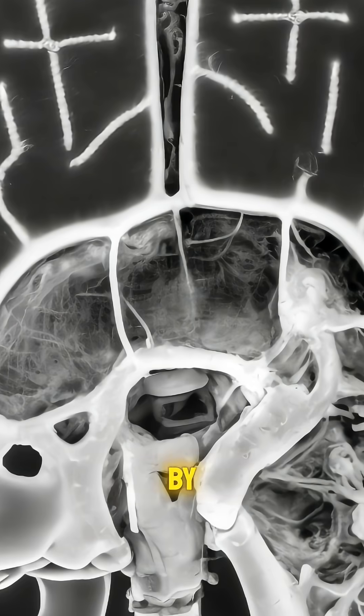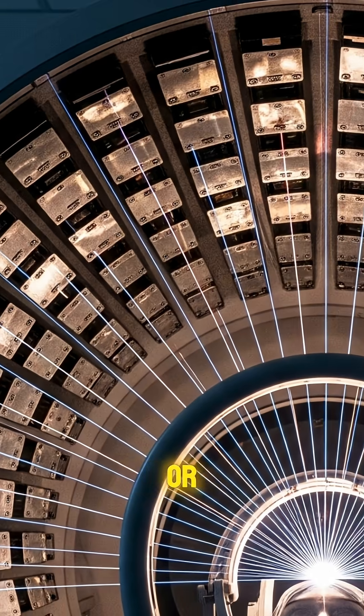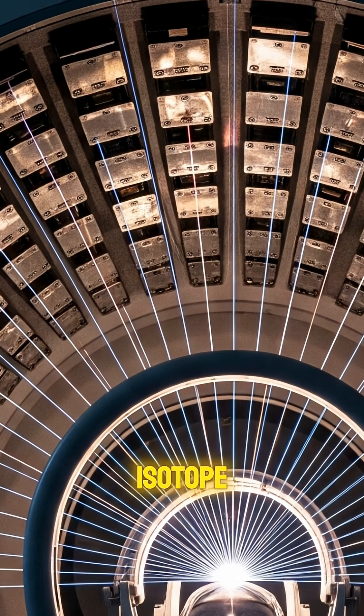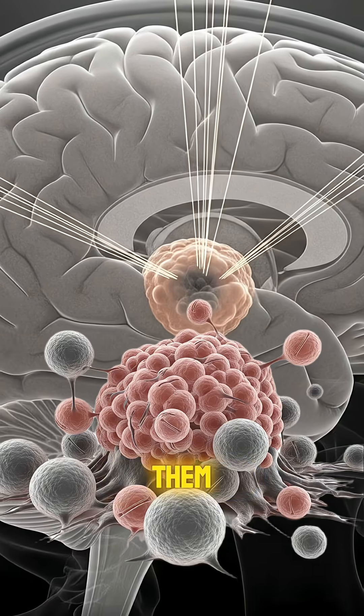The way it works is by delivering highly concentrated gamma rays to a targeted area from 192 or more sources of cobalt-60 isotope radiation in order to damage the cells of a tumor and prevent them from multiplying.